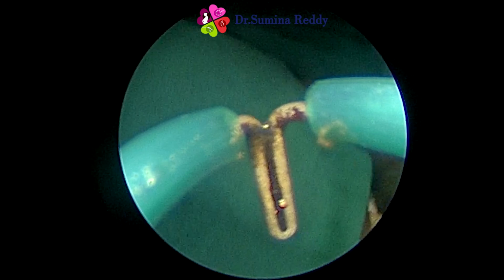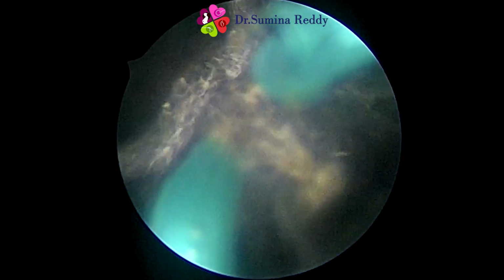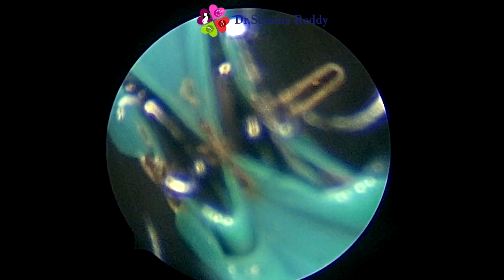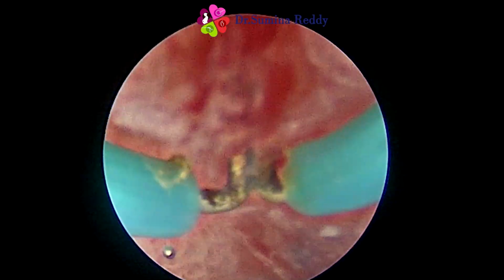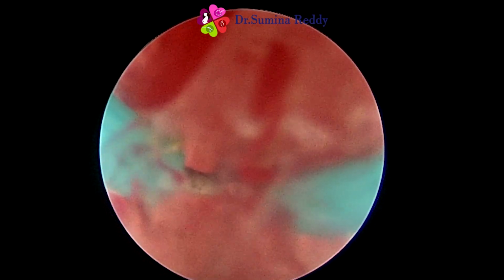For septal resection, we prefer a 22 French bipolar resectoscope. This is especially useful when there is a broad fundus. Normal saline is the distension medium chosen, and the bipolar electricity is used to resect the septum.